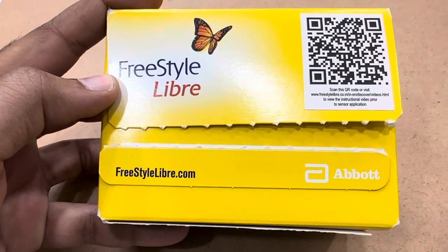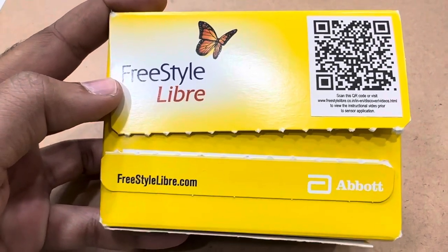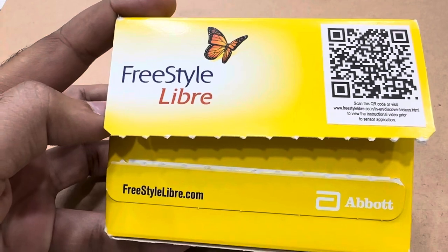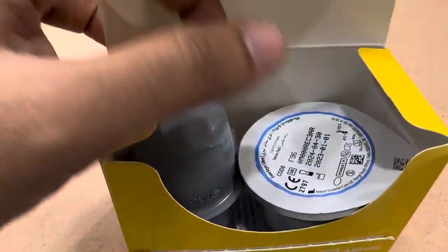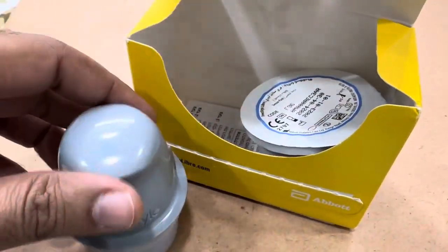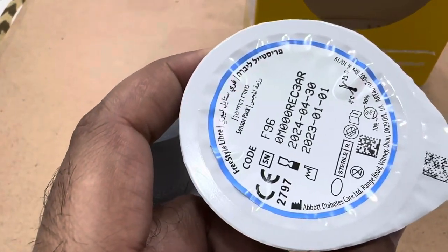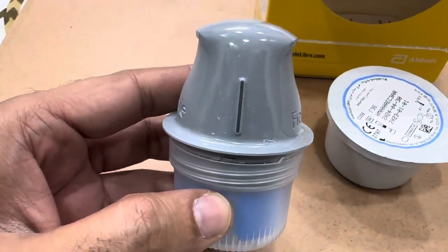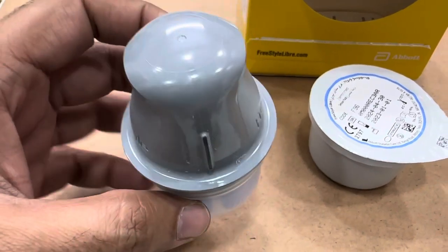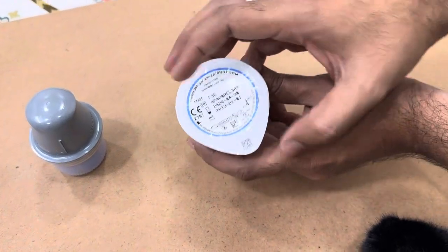Welcome to today's video — we're discussing the FreeStyle Libre sensor. Abbott has introduced the FreeStyle LibreLink app which works through your phone, so all you need is the sensor. When you unbox it, you'll see the FreeStyle Libre sensor and the applicator. This is the most important part — check the expiry date on the sensor before use.